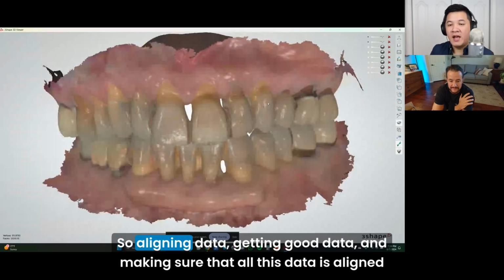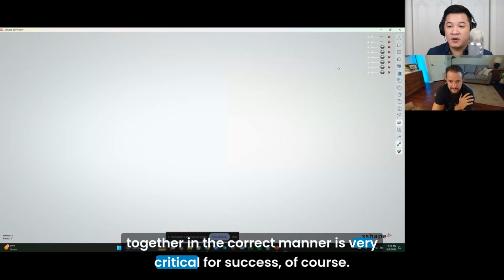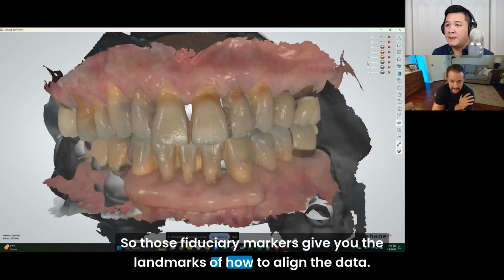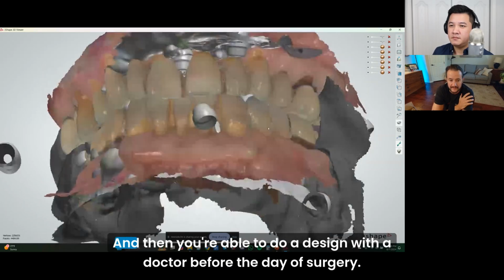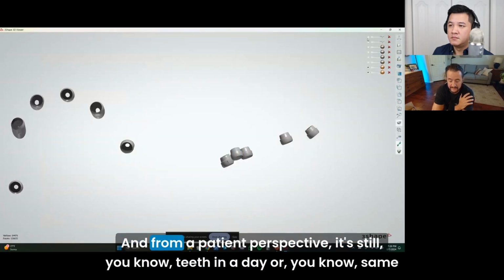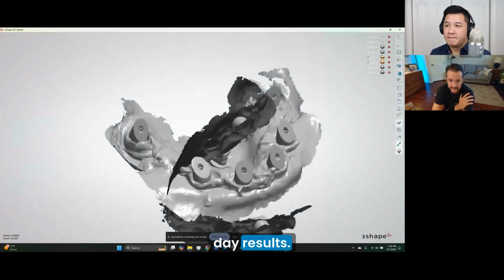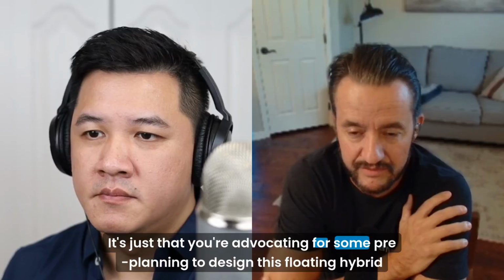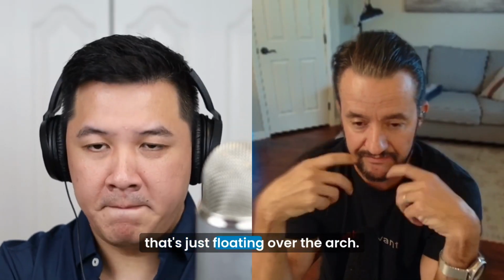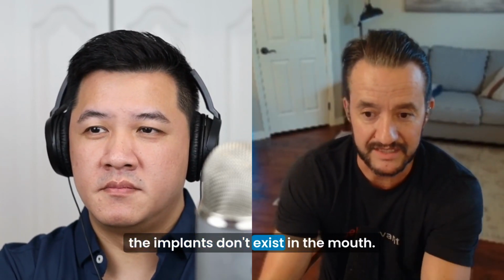So aligning data, getting good data, and making sure that all this data is aligned together in the correct manner is very critical for success, of course. Those fiduciary markers give you the landmarks of how to align the data. And then you're able to do a design with the doctor before the day of surgery. From a patient perspective, it's still teeth in a day, same day results. It's just that you're advocating for some pre-planning to design this floating hybrid that's just floating over the arch. There are obviously no screw channels in there yet because the implants don't exist in the mouth.